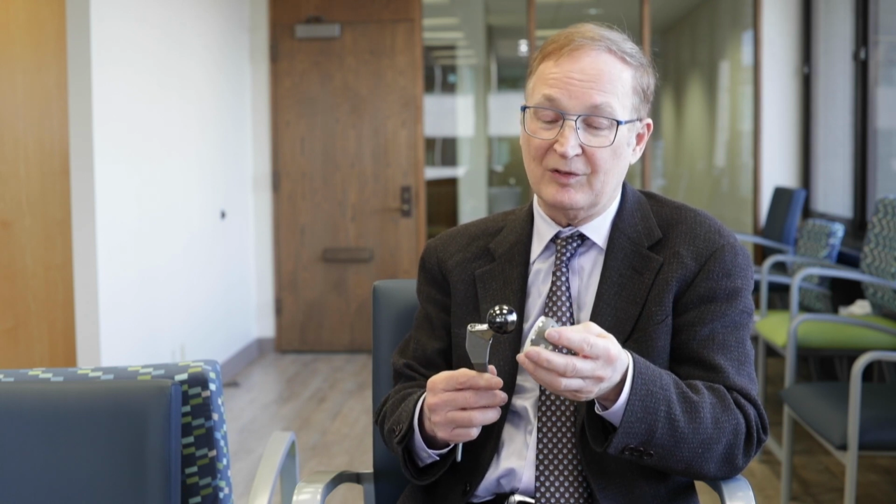Alternatives that have been suggested to a fully ceramic coated implant have been just the ball itself. Here's a product that's widely available, only costs a few hundred dollars more rather than several thousand more, where the ball is its own type of synthetic ceramic, and it turns it black. That has been useful to some degree. If somebody's not overly sensitive, it can be helpful too.